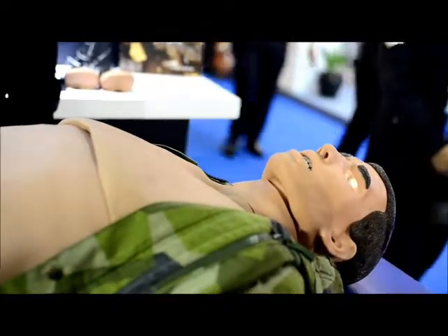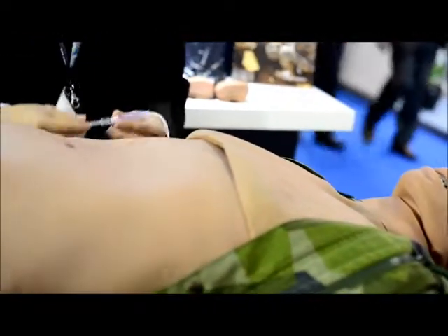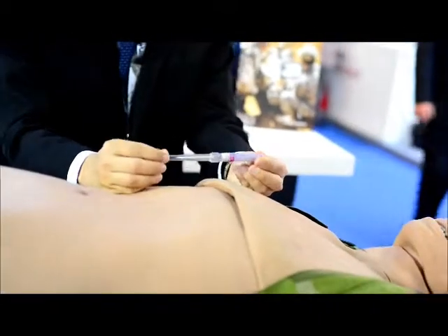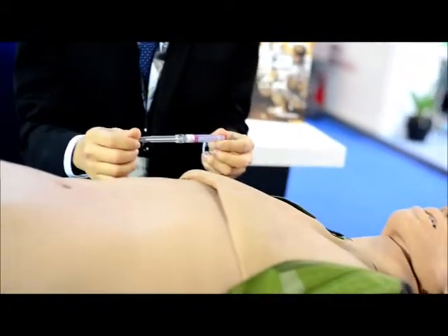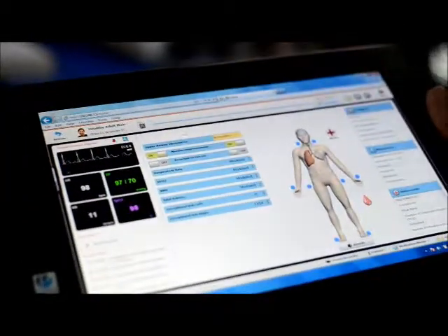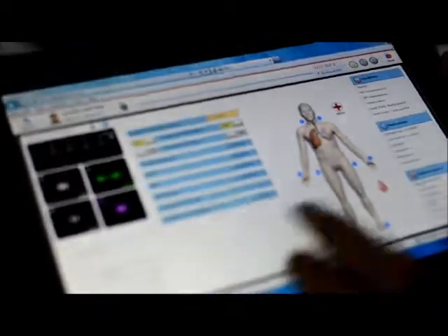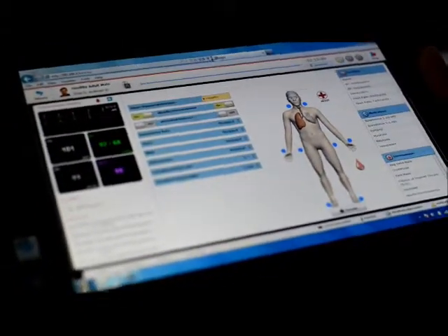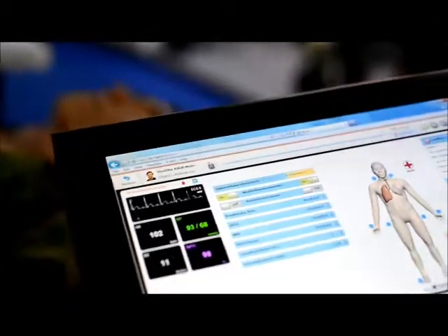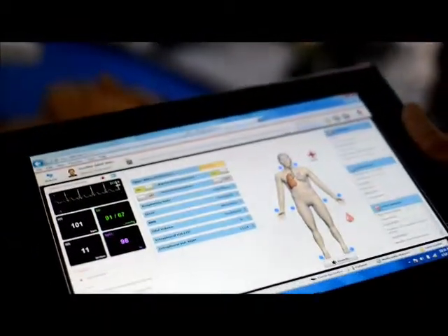With CESAR we are able to do needle decompression on the chest, and in this situation we are going to simulate it with the software. Right now we are going to simulate CESAR having unequal chest rise — the right side of his chest is obstructed. We are going to do a medical procedure called needle decompression to relieve his right side of his lungs.